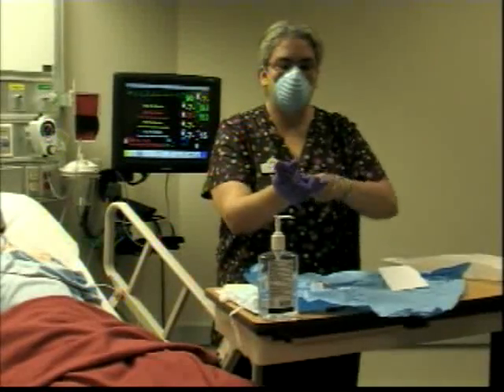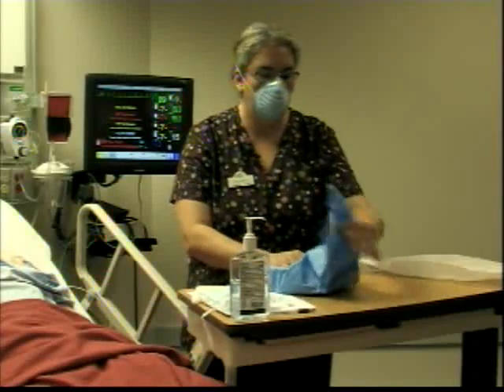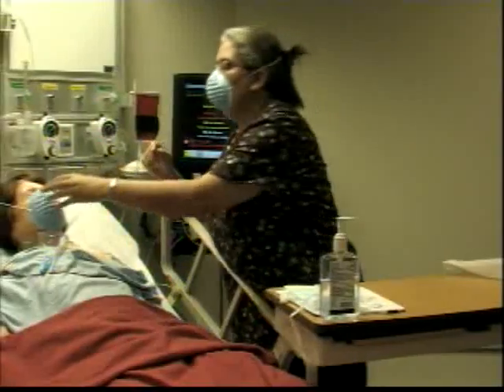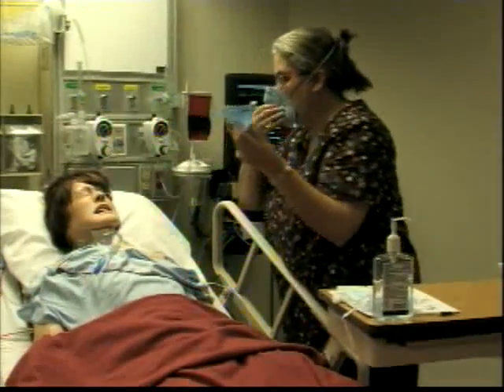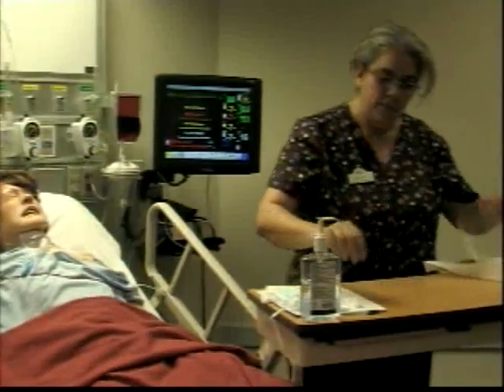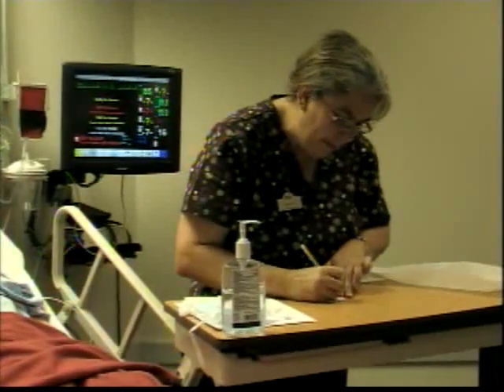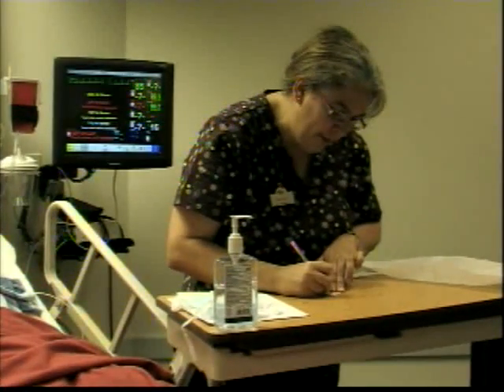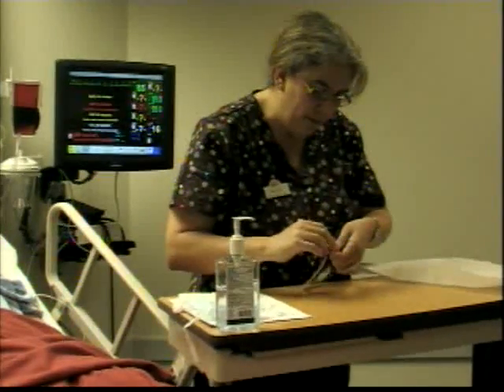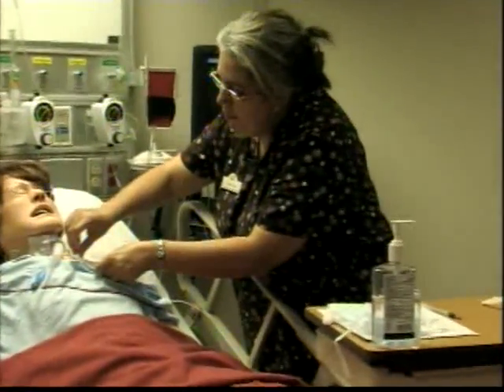You remove your gloves, same way we had done it. Put it inside, wrap it all up, put it into your red bag. At this point, you can remove your patient's mask, remove yours, put it into the red bag. Today is September 3rd. It's 1 o'clock in the afternoon, and my initials. And I'm just going to peel it off. Put it in a place away from the site.